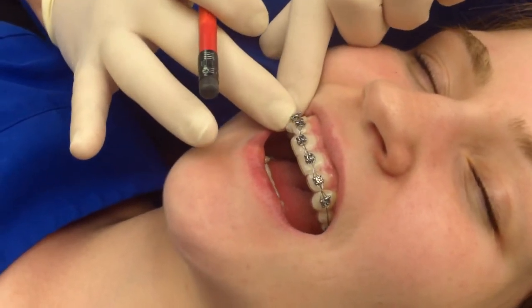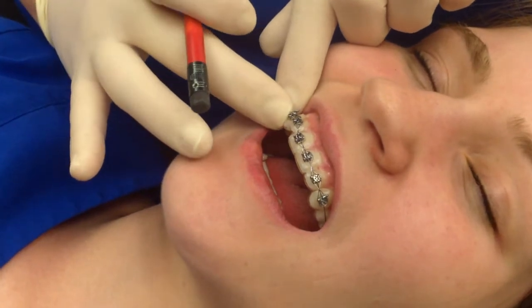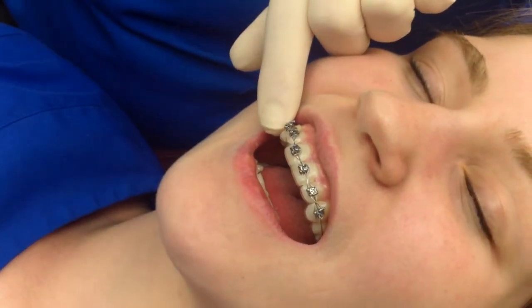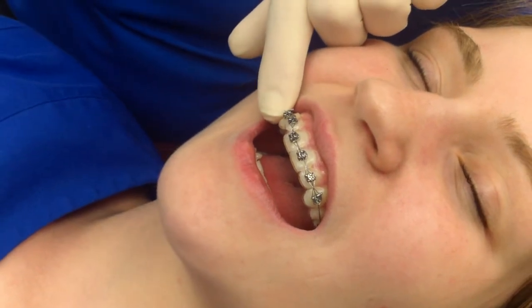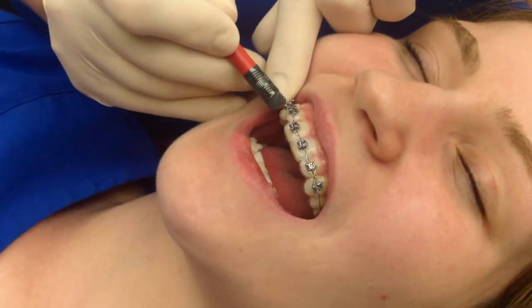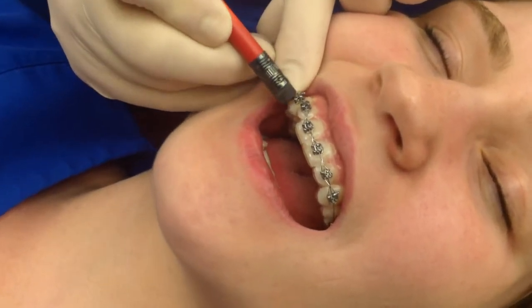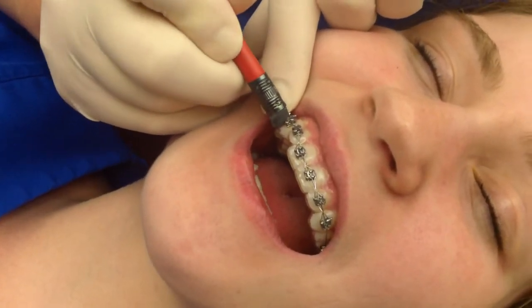Sometimes this wire, while you're brushing or you eat something, may be pushed out. But a home remedy is to take a pencil with a clean top of an eraser and just push it right back in, right under that wire, just snug it in and keep pushing until you get it in.